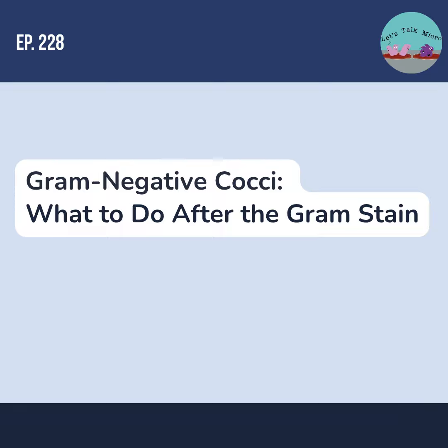This system consists of a modified Thayer-Martin plate, and I will talk about that, a tablet that generates CO2, and a plastic bag. The tablet is composed of sodium bicarbonate and citric acid. Very simple, the setup. You inoculate the plate, and you place the tablet in a well that the plate has, and then place the plate in the bag. And what happens is that moisture activates the tablet, which generates CO2. And then you transport this to the lab and incubate it at 37 degrees in a CO2 incubator. And something to note is that this system is also recommended for Neisseria meningitidis.